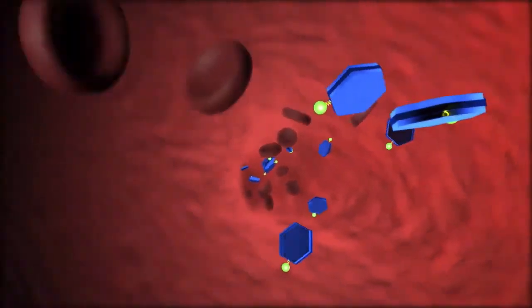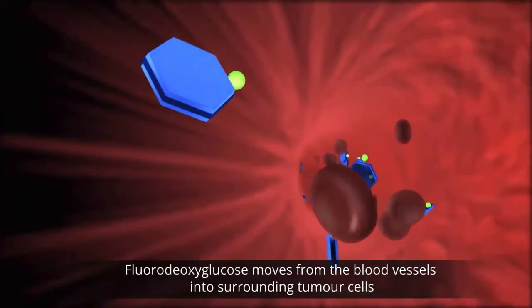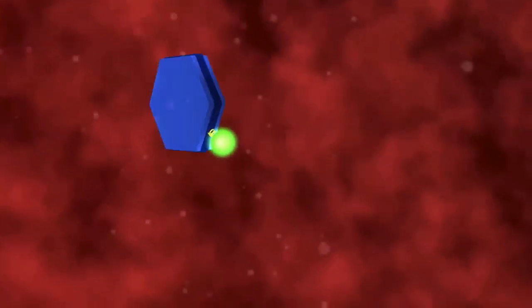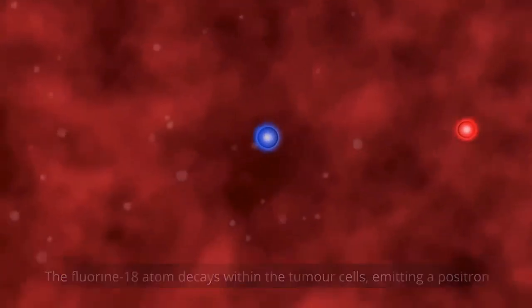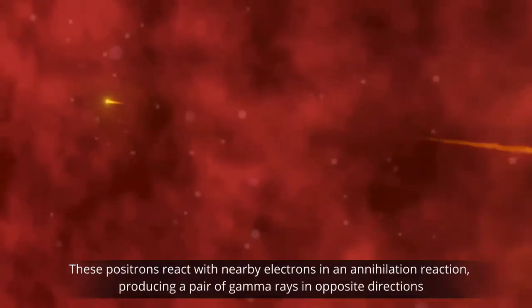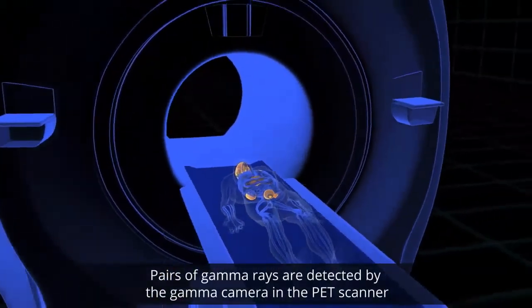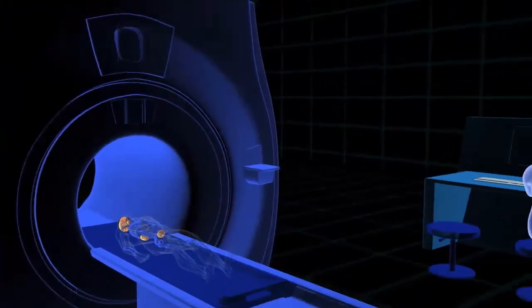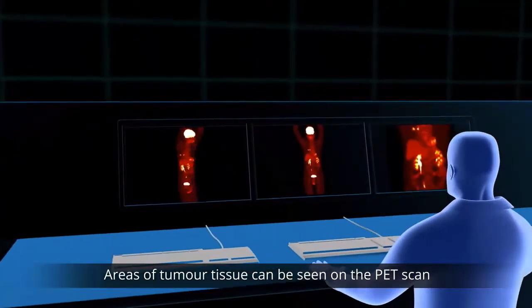And so this is going back to your bloodstream, where your radiotracer distributes, it diffuses out of your bloodstream into the tissue. The F18 decays, it meets an electron and annihilates, giving away two 511 keV photons. And that's what we're detecting in the PET scanner, right? And then magically the image appears on the screen.